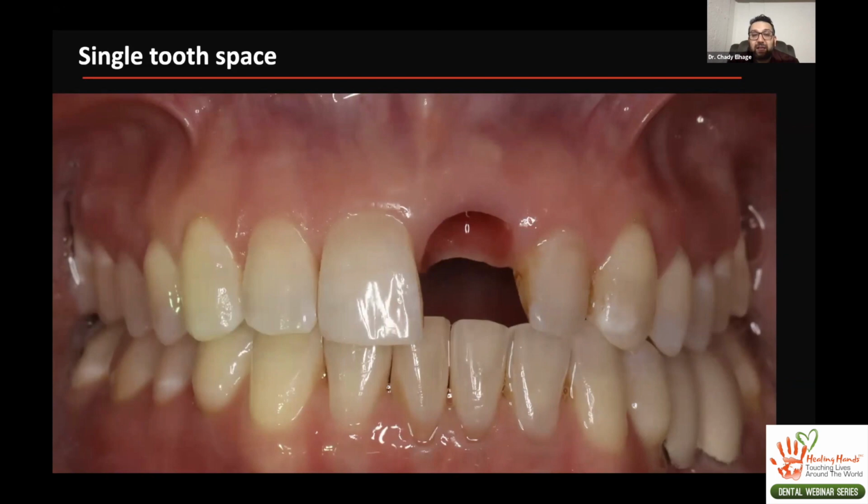That's really what you're looking for when you remove these restorations. You can see that papilla, that scaffolding. Obviously, on the lab side, you have to be able to create a restoration that mimics exactly what you have in place.